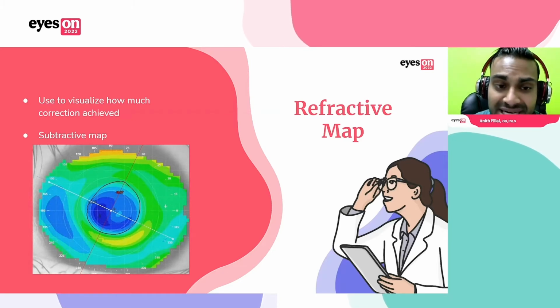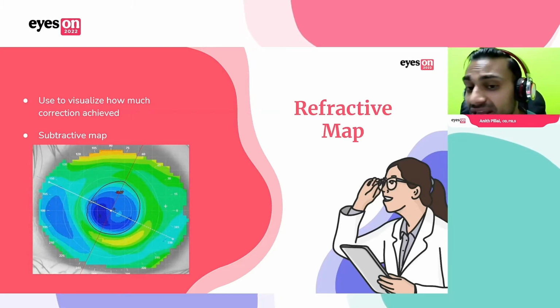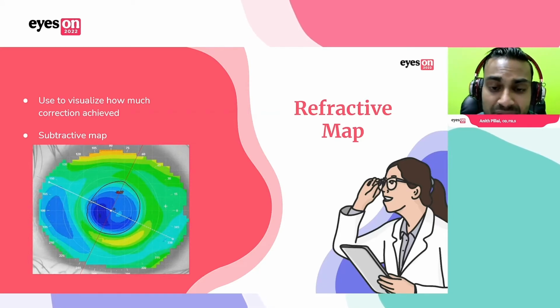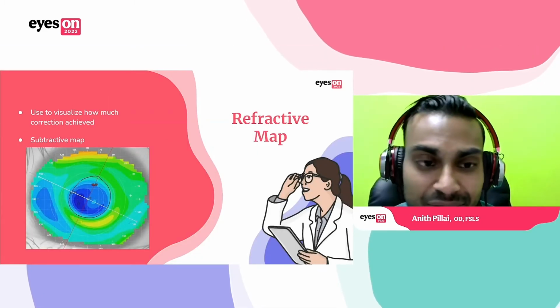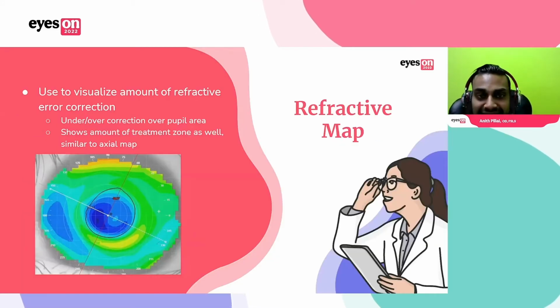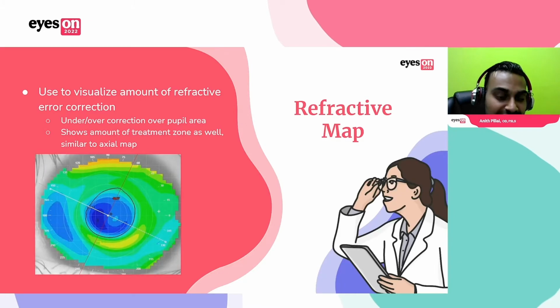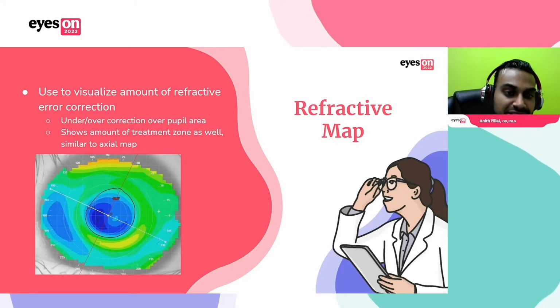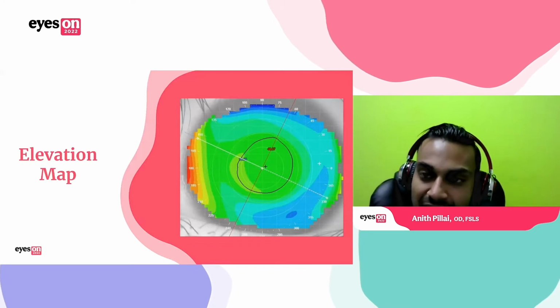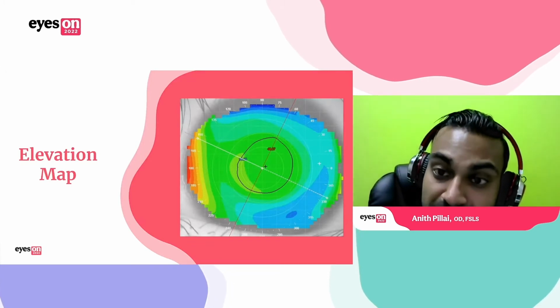So using the refractive difference map, I can go in before I even see the patient, see, all right, I've corrected 4 diopters of myopia, 5 diopters of myopia on this corneal surface. And if my manifest refraction doesn't equate because the kid's just tired that day or just all over the place, at least I have an objective finding to back me up. And again, similar to the axial map, it shows that treatment area very well if it's well centered and within that pupil zone. All right, and the elevation map, this I use primarily for design purposes.